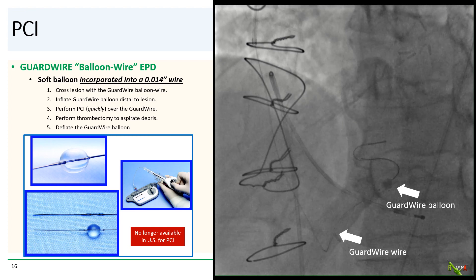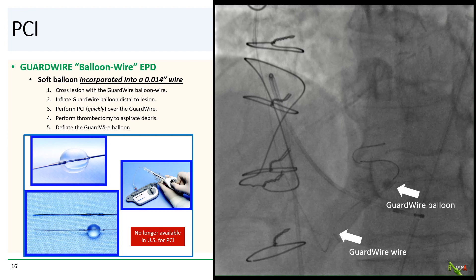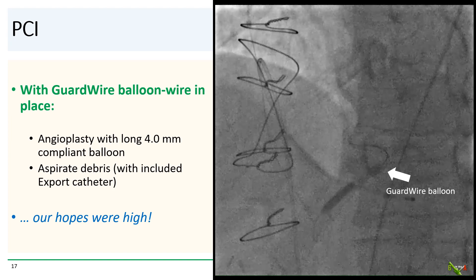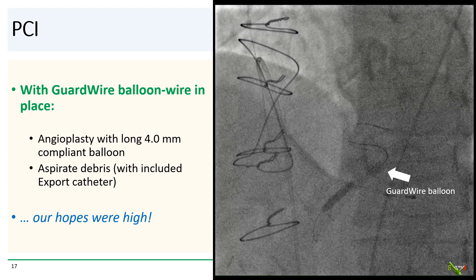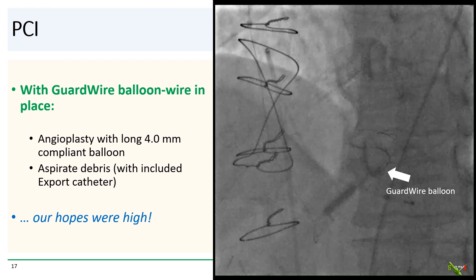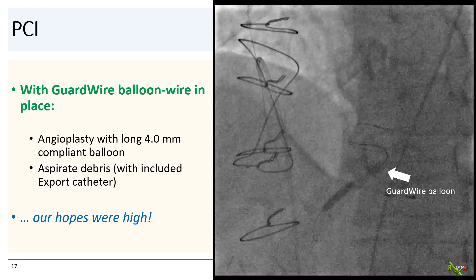Here you see the guard wire in place with its balloon inflated at the end of the vein graft. Unfortunately, the guard wire is no longer available in the U.S., at least for coronary interventions. With the guard wire balloon in place, we went ahead and dilated the mid to distal portion of the graft with a 4.0 mm balloon, and then aspirated the debris with the export catheter.